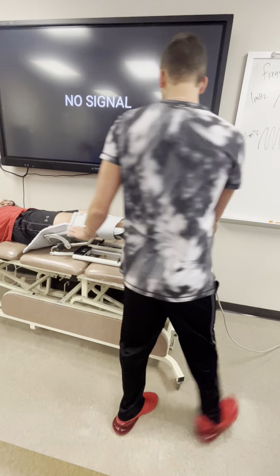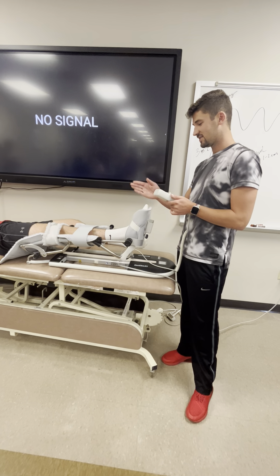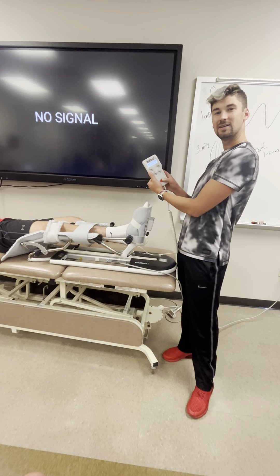Okay, Alex, you look great. We are the top with this. Okay, the bottom. Great.